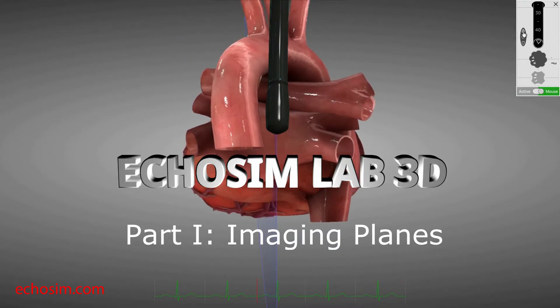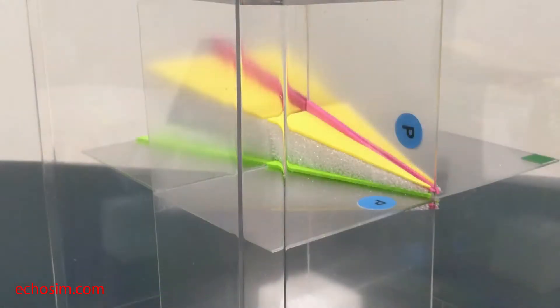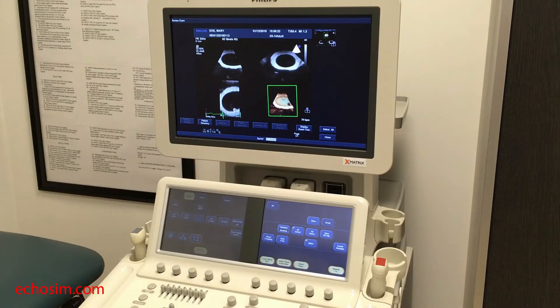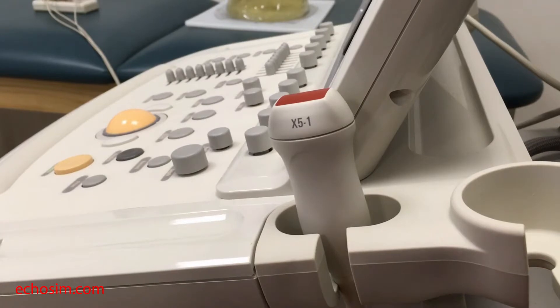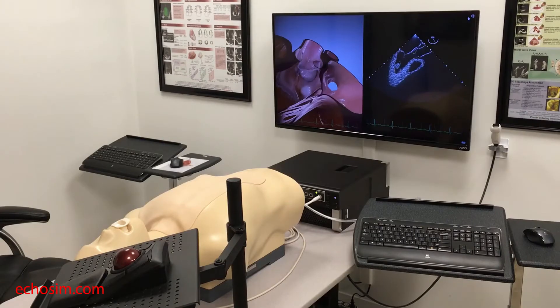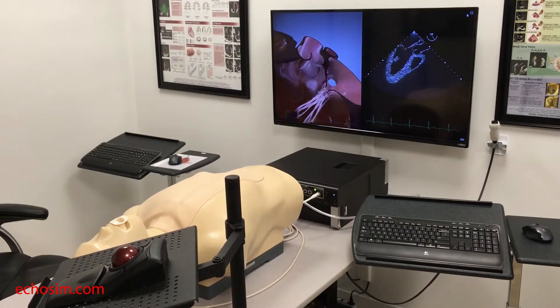Our 3D training laboratory uses a 3D model, a 3D target phantom, a synthetic ECG, a Philips IE33 matrix ultrasound machine, a 3D X5-1 TTE probe, and a HeartWorks TEE simulator to train our attendees.